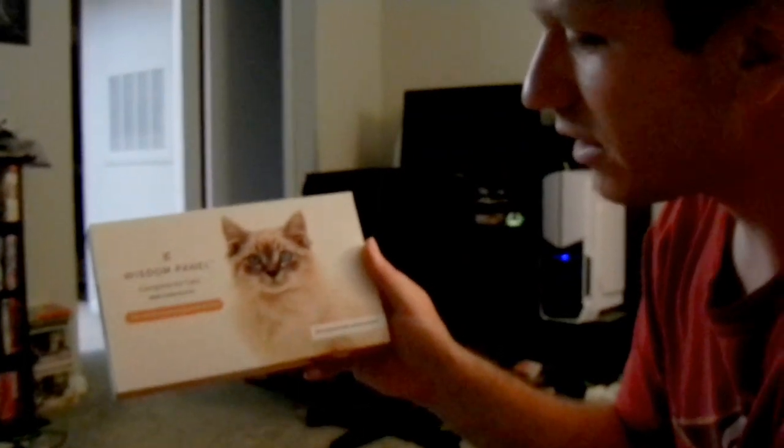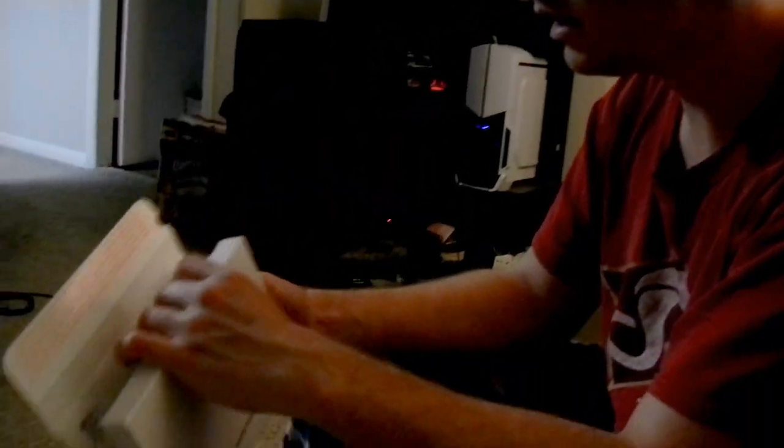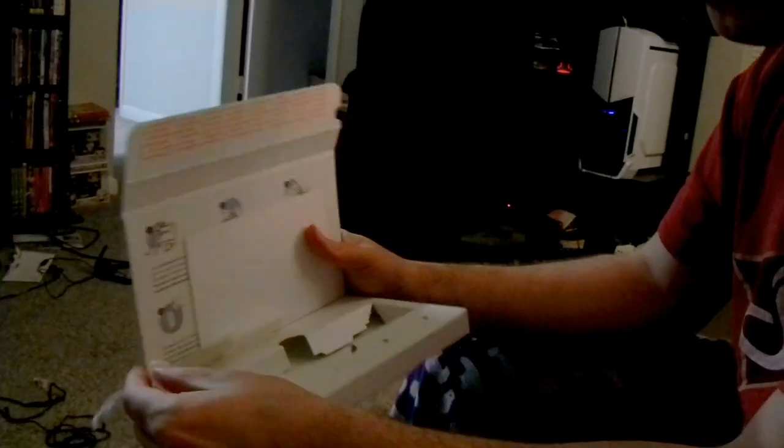We got a Wisdom Panel, which is supposedly the world's leading DNA service developed with veterinarians, not veterans. When you open the box it says 'do not destroy'—this is your shipping container, and on the back there's a big USPS shipping label. It's got the sticky stuff to put it back together, and if we flip it open, it's got the swabby like a COVID test.